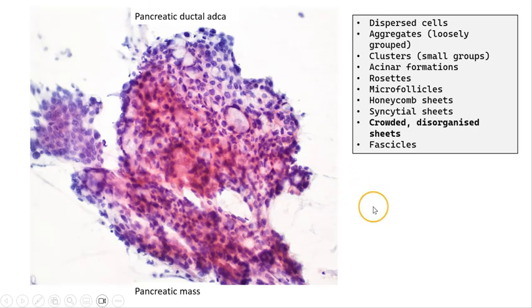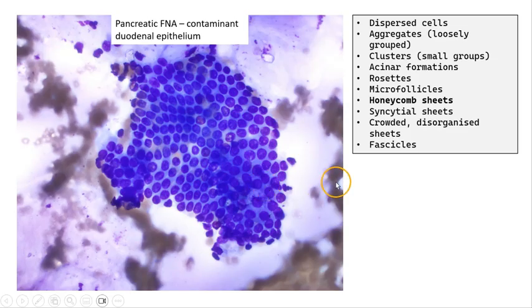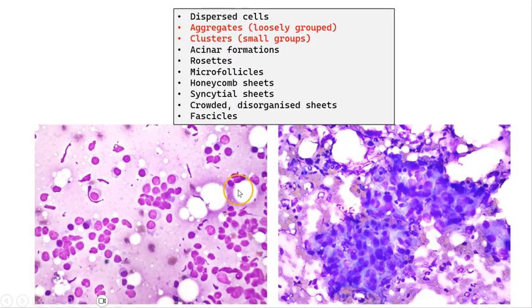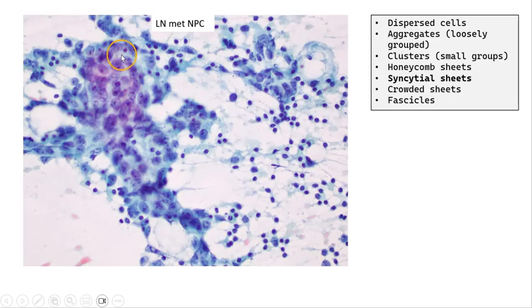This is a classical example of pancreatic ductal adenocarcinoma. In contrast, this is a honeycomb sheet, and often we see this in contaminant gastrointestinal epithelium — as you can see here in a pancreatic FNA, this is a honeycomb sheet of contaminant duodenal epithelium. Here is a comparison of aggregates, where the cells are still discohesive but close together, versus clusters where the cells are truly cohesive. This is an example of a lymph node featuring metastatic nasopharyngeal carcinoma, undifferentiated type, described as a syncytial sheet, where the cytoplasmic outlines are ill-defined.